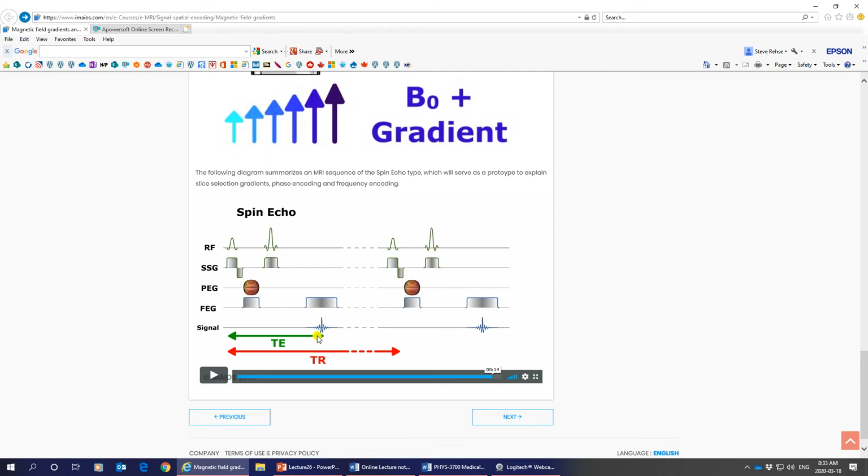And then, of course, what we learned in the last lecture is after your experiment's completely done, you wait a time TR, the repetition time, you hit it with another pi by 2 90 degree pulse, and you start the experiment all over again. And as we saw earlier, this will be on a different row in the axial slice. So last lecture, you saw this RF, and you saw this signal. This is that echo coming in. You have to draw that.